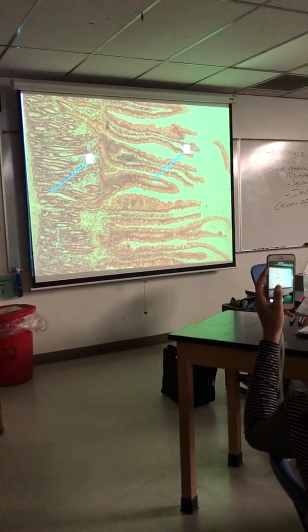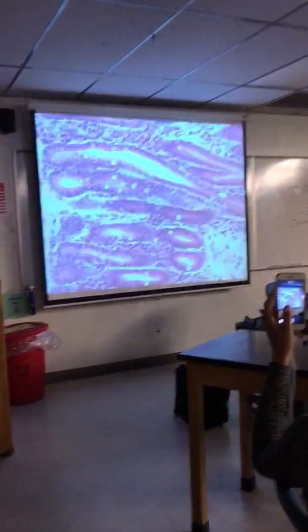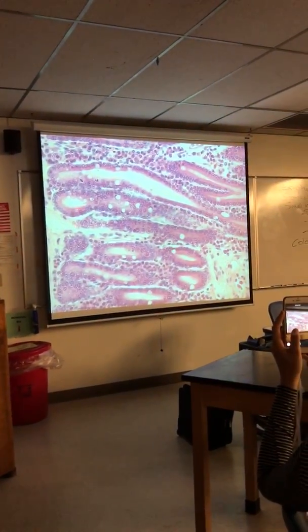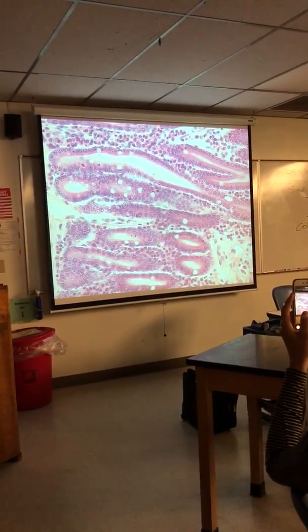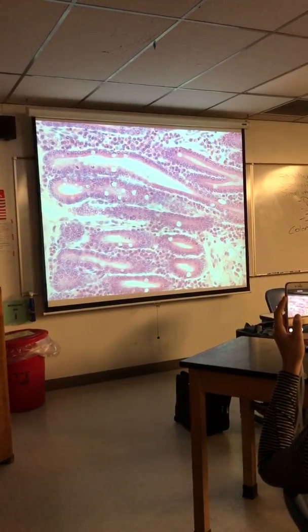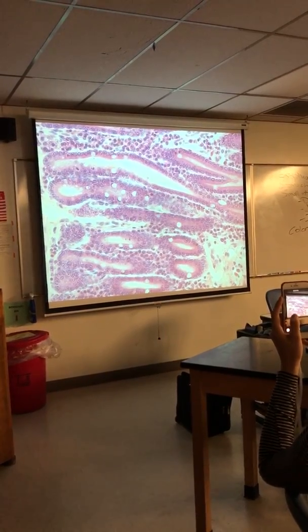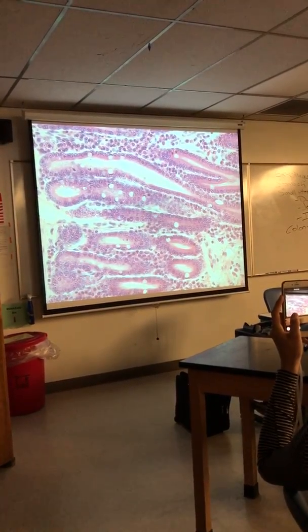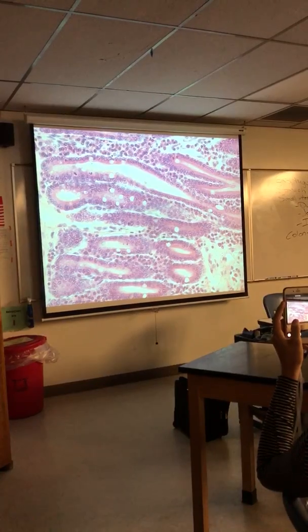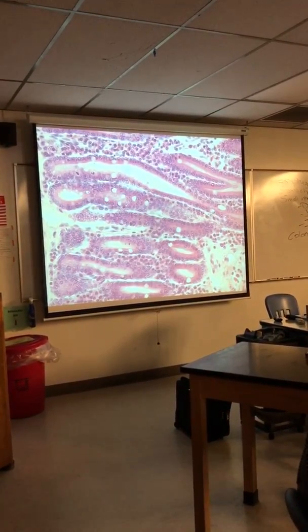So is that the villi or the crypt? Villi. That's the villi, that's the crypt. Here's a close-up view of the crypt with the Paneth cells. You do see some goblet cells deep in the crypt, but if I ask you to identify a red cell, it's a Paneth cell. So look, that's the intestinal crypt, or you could call it the crypts of Lieberkühn with Paneth cells. Where are the Paneth cells? Any cell that's red. Okay. Any cell that's clear is a goblet cell.